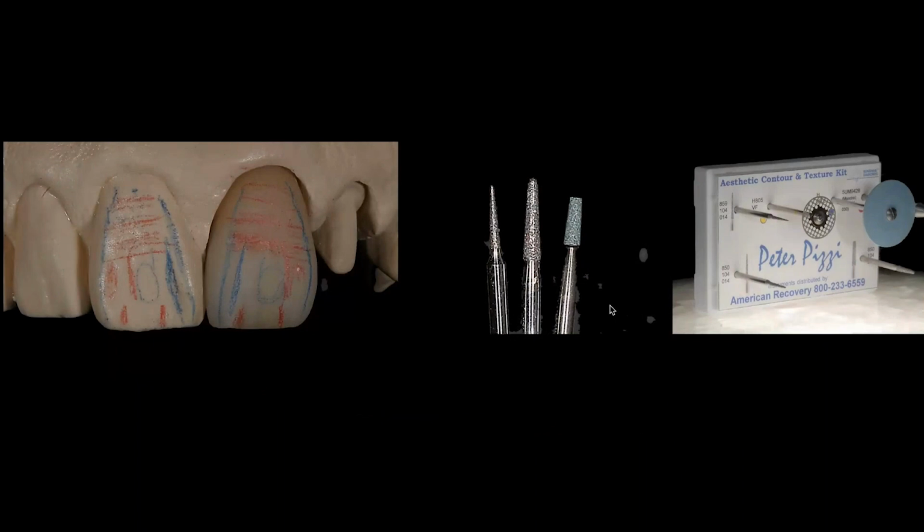And by the way, it's even more complicated when I get into monolithic materials, and we're trying to work in the green state, trying to find the right materials or the right burrs, and maybe even knives or dull burrs or things that I could use to give me the right angulation of a cut into either a natural restoration or into a monolithic restoration, which becomes really challenging for us.